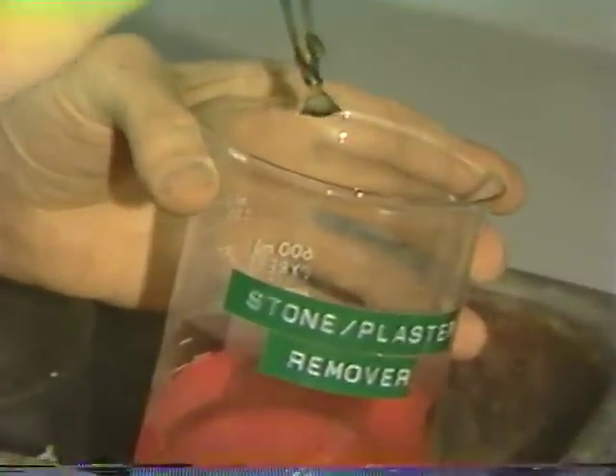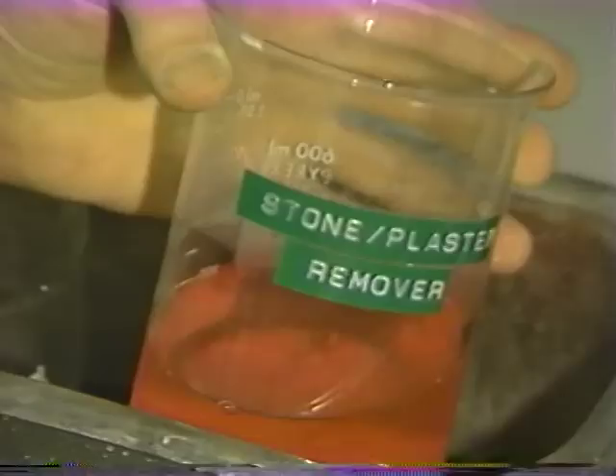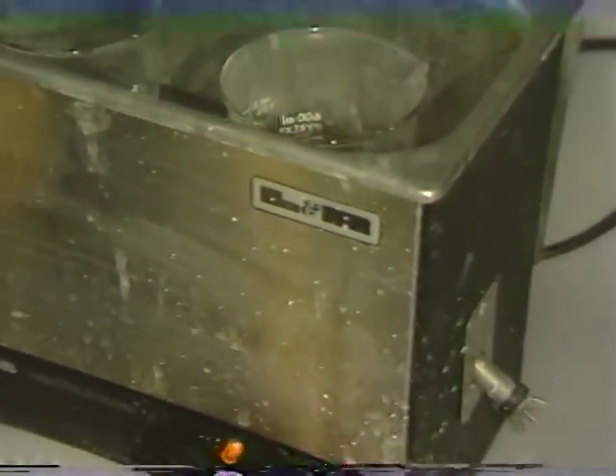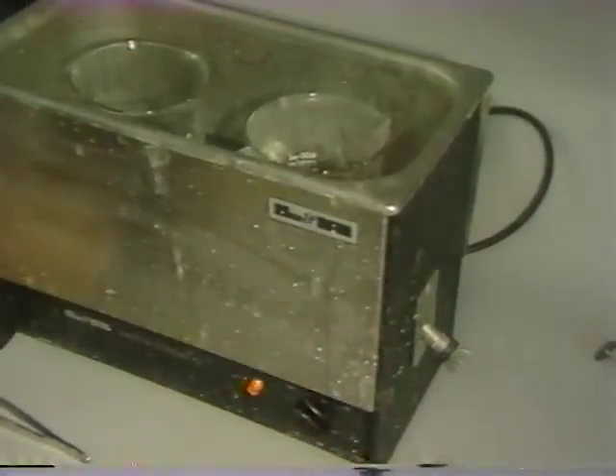The casting is carefully placed on the bottom of a container with general purpose or preferably stone and plaster remover, which is placed in one of the ultrasonic units, turned on for a cycle to make sure that all investment is indeed removed.